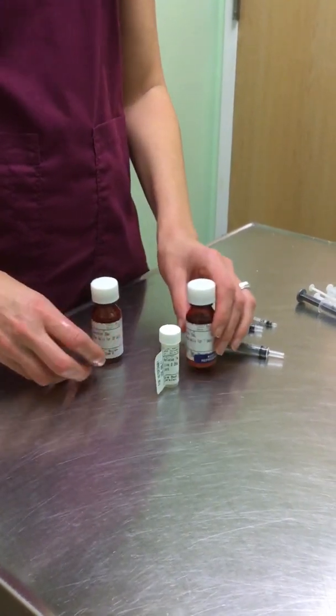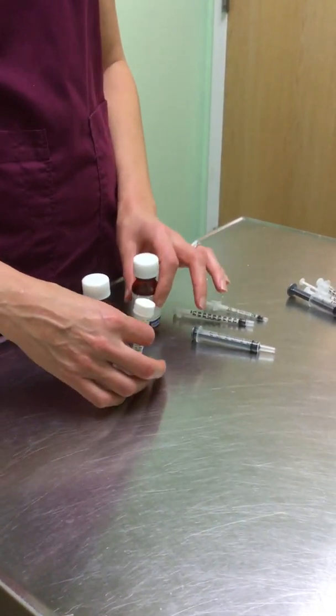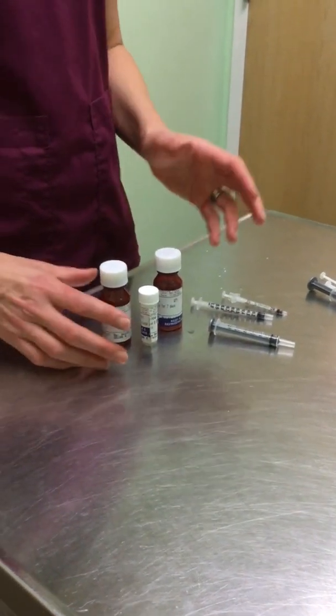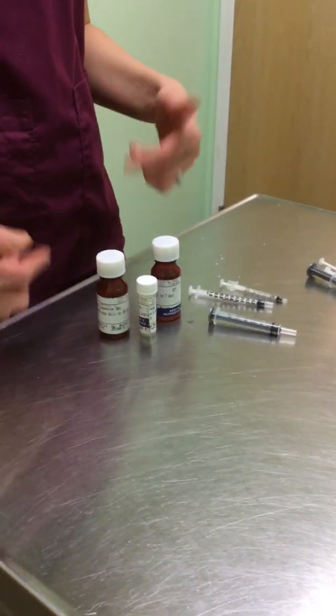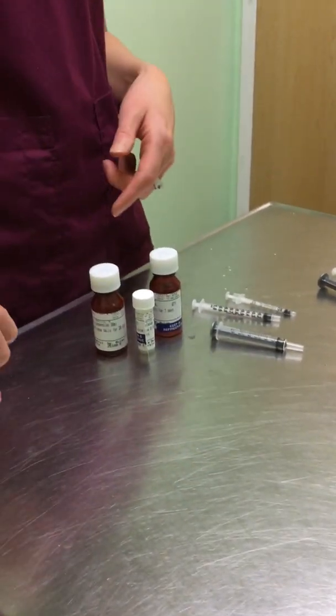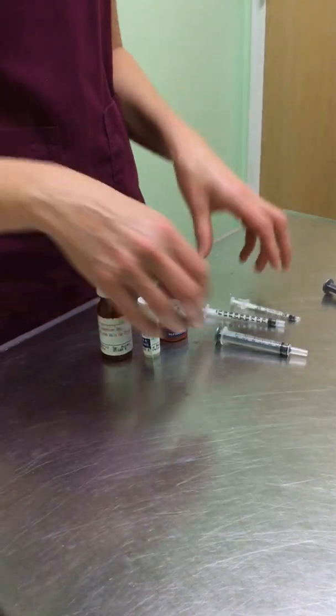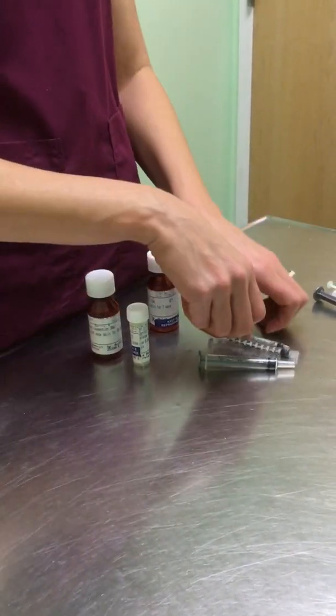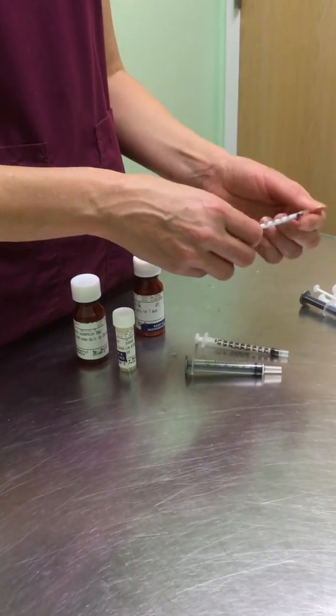So today I'm going to be demonstrating some techniques for how to properly draw up medication. With exotic animals, we mostly are going to be using liquid suspensions rather than pills or tablets or capsules that you might give to a dog or a cat. We work with compounded liquid flavored medications instead. We generally are going to be sending you home with some syringes.